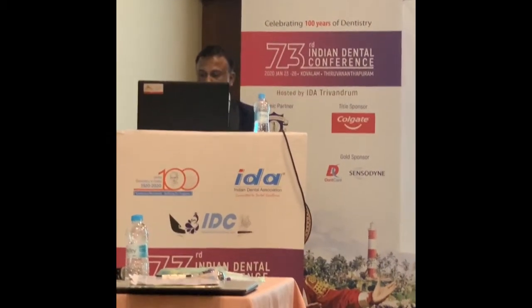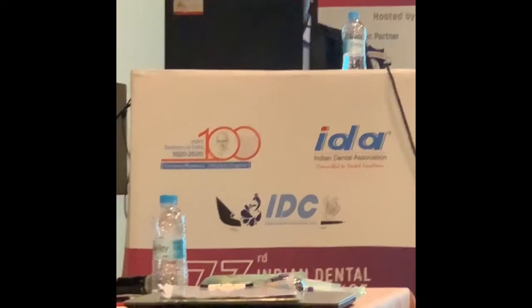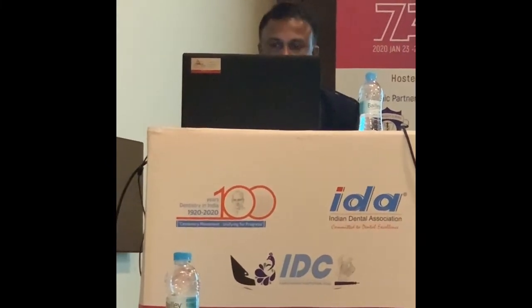So the study models are done, and the cast is bound, a lot of prosthetic work, because occlusion plays a key factor. Of course, you can find out using these balls, the stainless steel balls which you can use, to find out the magnification error. Because when you take an OPG, there will be some magnification in that. So you place these balls there and take an X-ray, and you know the actual diameter of the ball, because you have it in your hand and you know the magnification error.